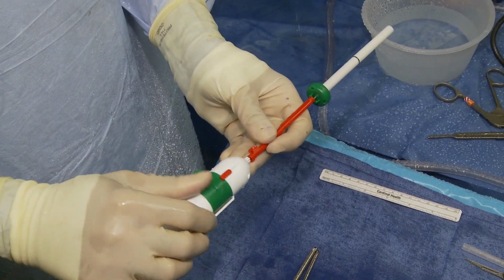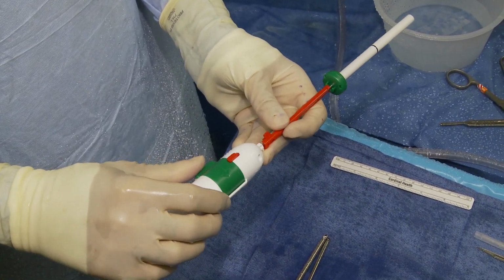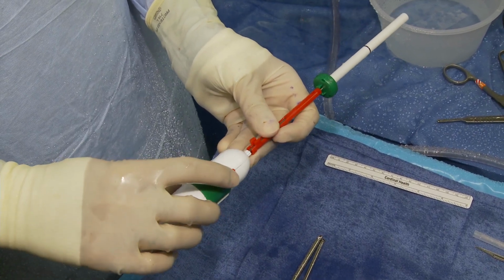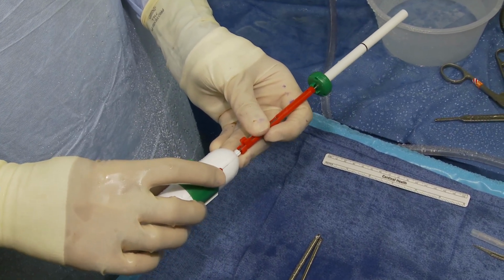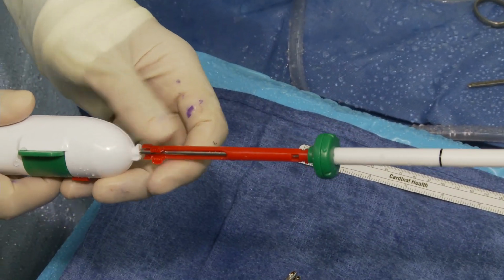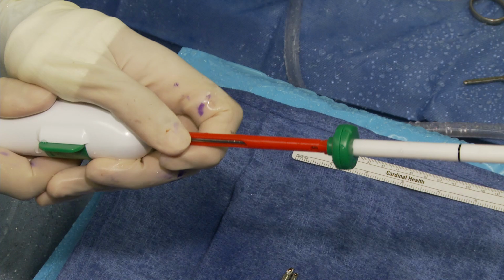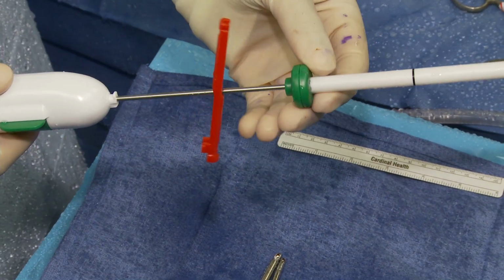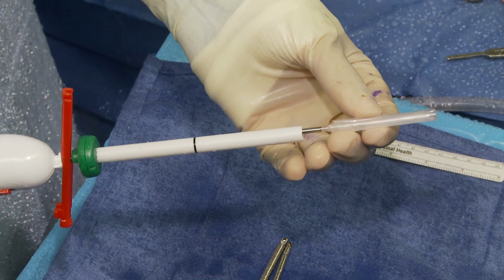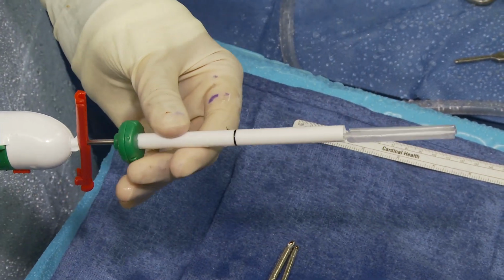This green tab is actually the deployment tab that will be used when you're ultimately ready to deploy the device within the subacromial space. The red lever here just prevents you from doing that prematurely. This is a backstop device that prevents you from prematurely exposing the device. In this case, I'm going to flip it up just so you can see how we can now slide down the sheath, and that exposes the balloon, which is ready for deployment within the subacromial space.